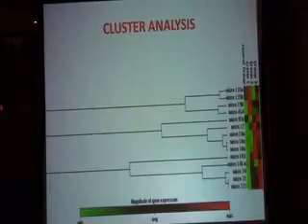Group 3 is the carcinoma, group 2 is the adenoma, and group 1 is the inflammatory bowel disease and the control group. And we can see that there is a change through the cascade from the normal control or the adenoma to carcinoma. So what's completely green in the control group turned into red and green in different sides.